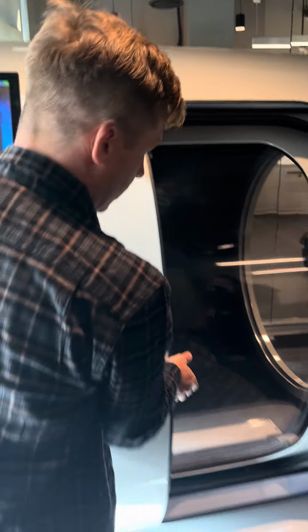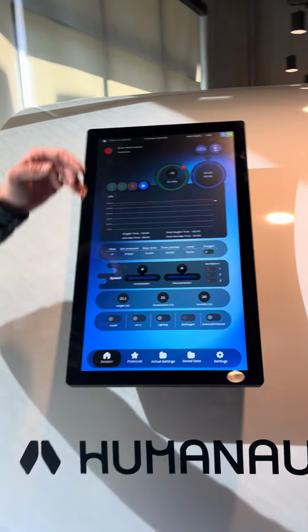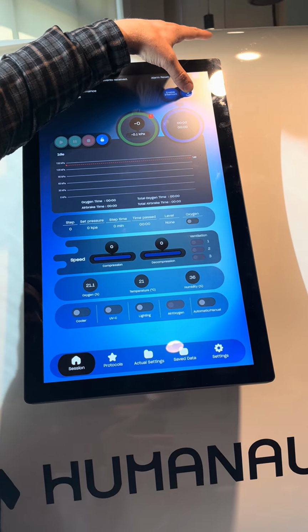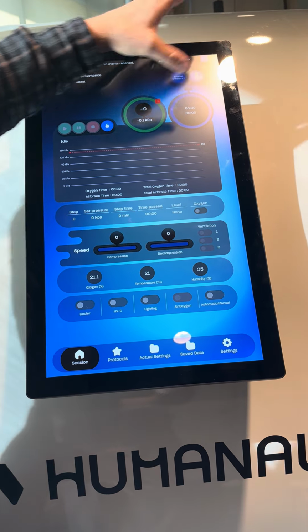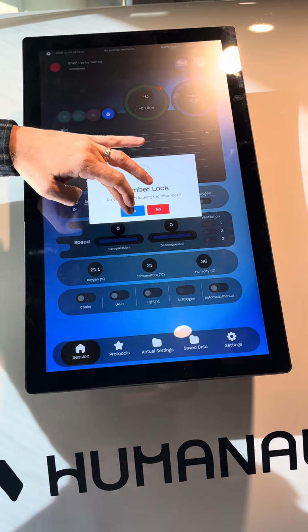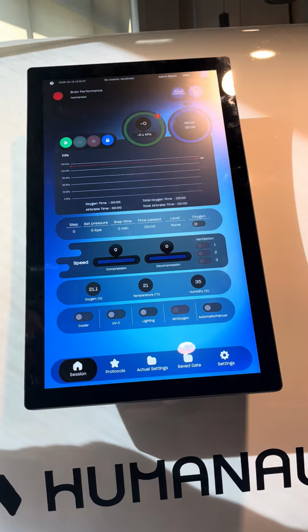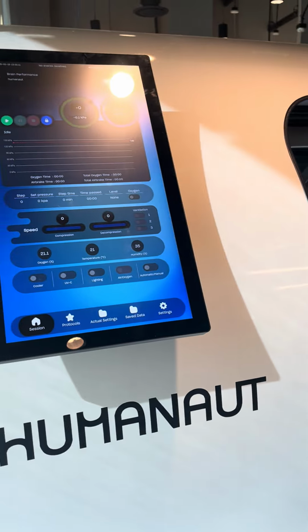Okay, so the door is fully shut and seated. And now, push to talk, door shut. Are you guys ready to start compressing? I'm going to lock the door. Door is locked. I think the compressor's closed right now. It's okay.